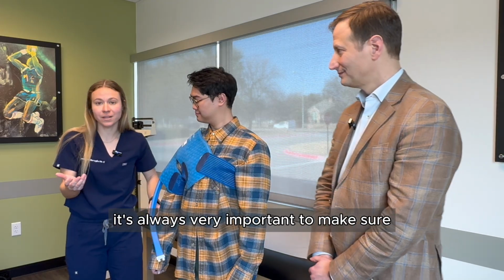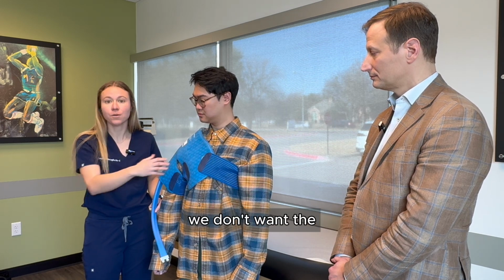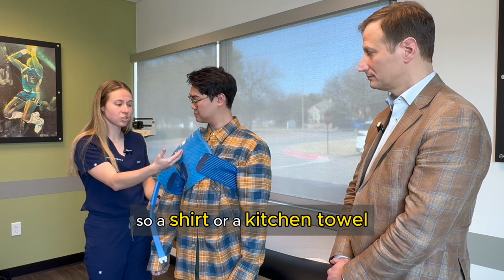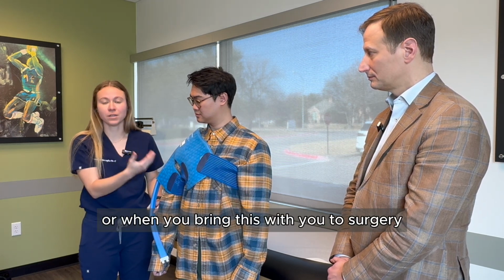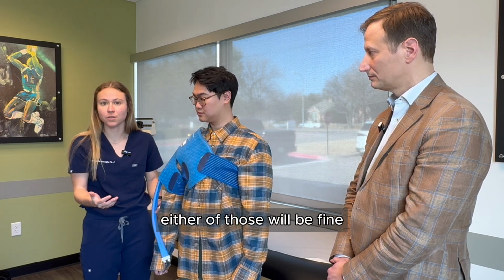It's always very important to make sure you keep something in between the pad and your skin at all times. We don't want your skin to get too irritated because of the icing. So a shirt or a kitchen towel, or when you bring this with you to surgery, you'll wake up with a blue towel underneath it. Either of those will be fine.